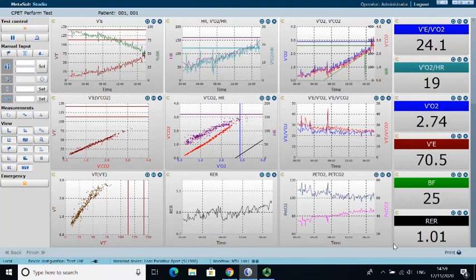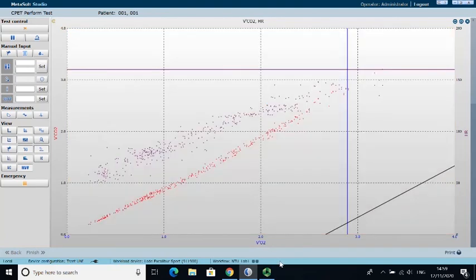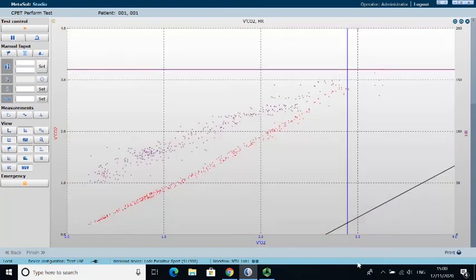And we can start to see now, there's multiple reasons why, but Matt's ventilation has increased quickly. So he's been fairly steady, and then all of a sudden he's started to increase it quite quickly, and that's because of an extra input of CO2 into the body through a bit of anaerobic respiration.